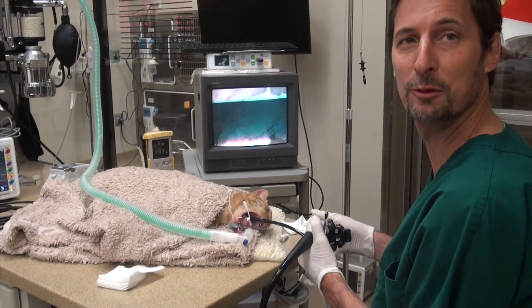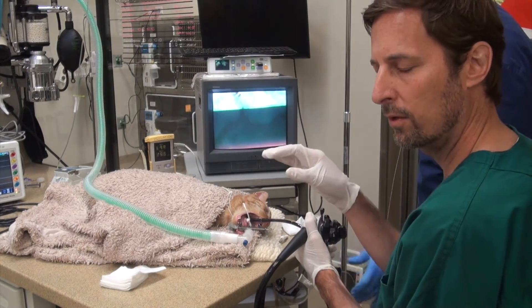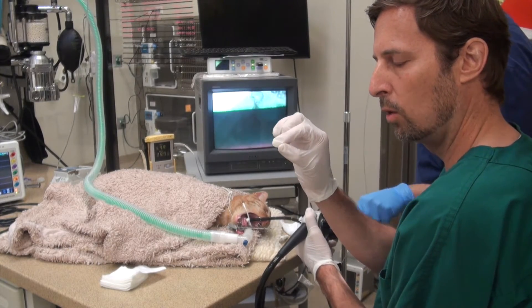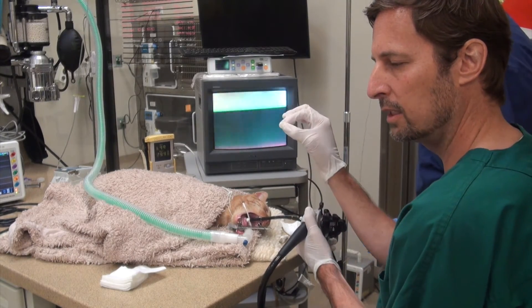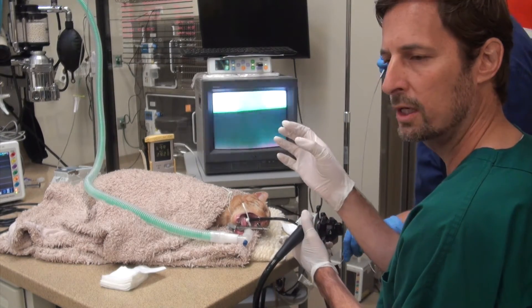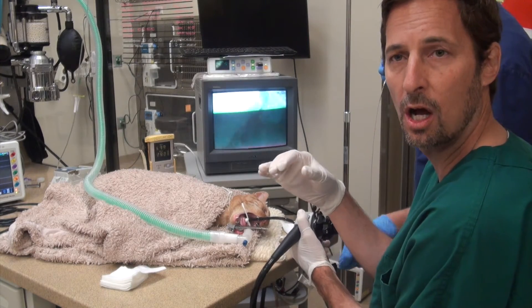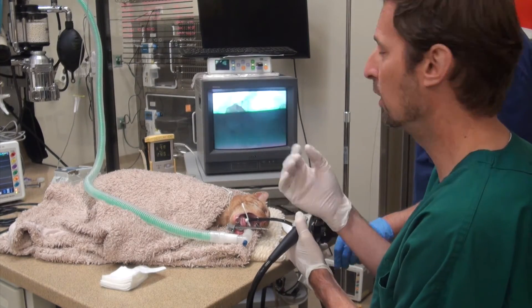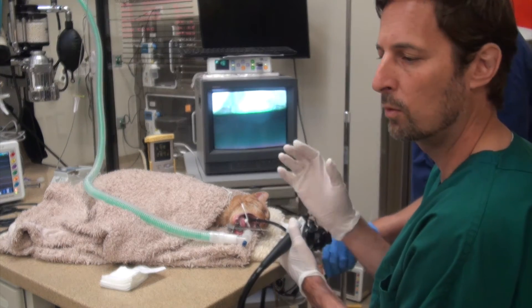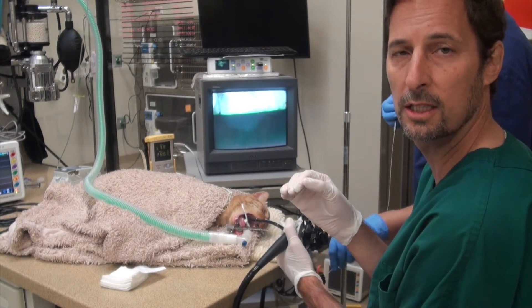Alright Cesar, you have the graspers? Yep. This type of foreign body would have gone down the stomach and gotten hung up on one part, and the whole yarn would go down the intestines and then the intestines would plicate or kind of form an accordion over it. And then the yarn or string serves as a saw — so it can be very fatal if we don't get this out right away. It's very good that the owner observed this and we were able to go in here and get it out of the stomach before it actually went down into the intestines.